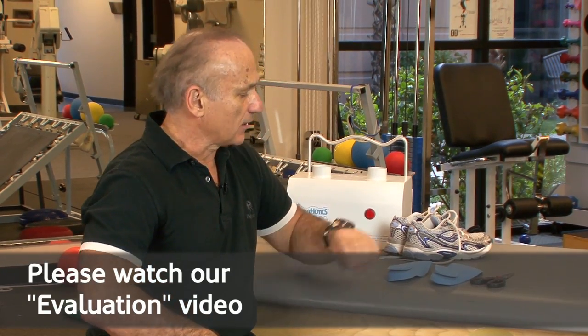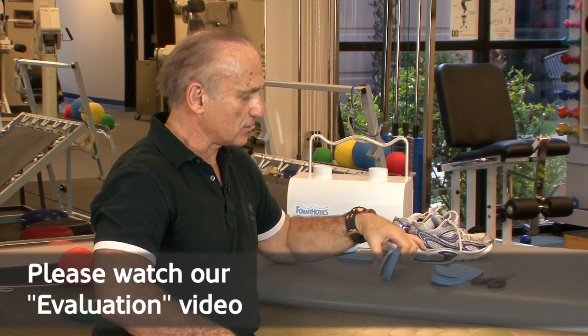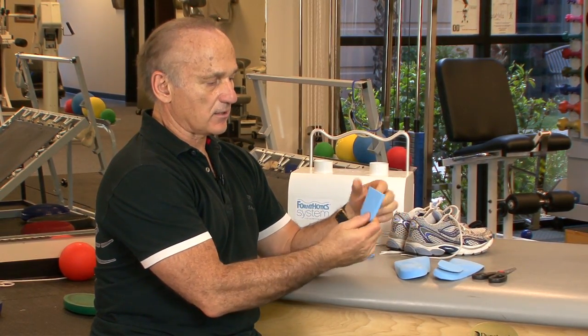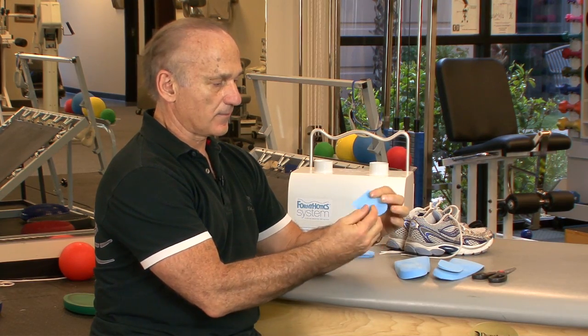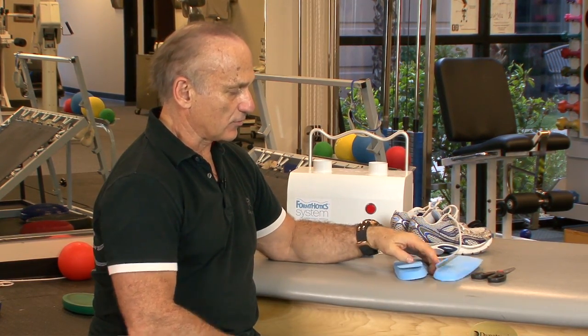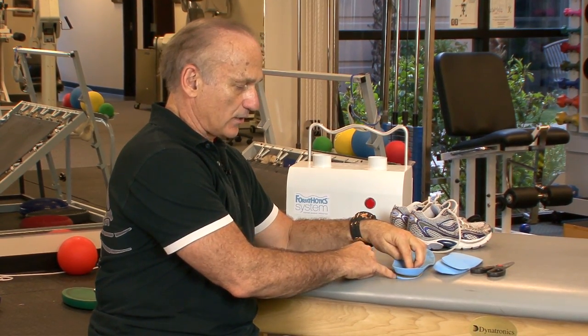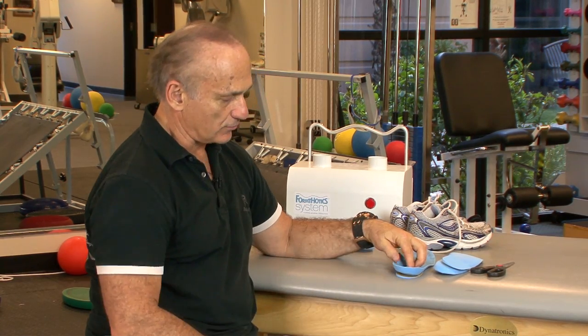Now we're going to talk about the fitting of the orthotic based on the evaluation. The evaluation gives us guidelines — for example, we saw excessive eversion of the calcaneus on both sides relative to the lower leg. I can correct that posture by adding a wedge, which is a little thicker on the inside. For an over-pronator where we want to control eversion, we put it on the medial side of the orthotic.